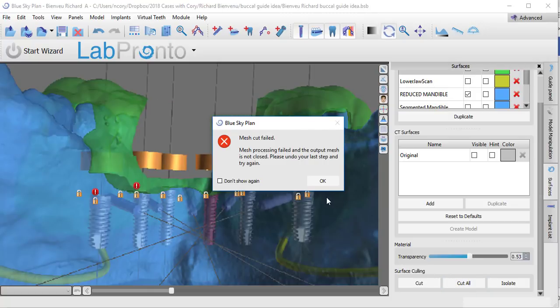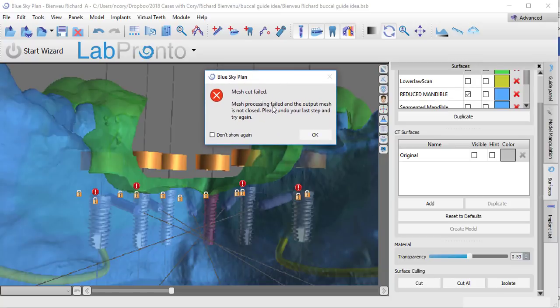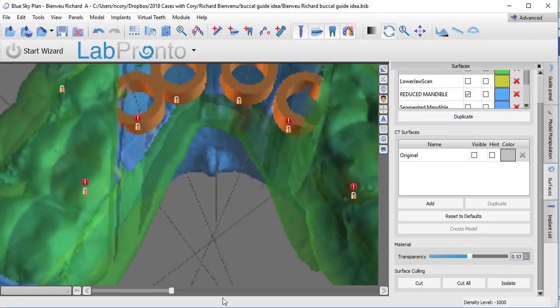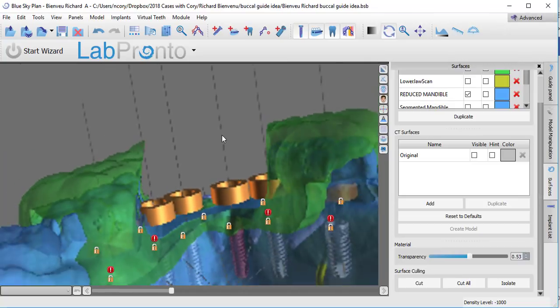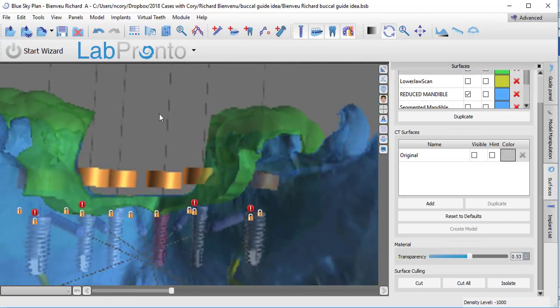All right, there's cut number one. Now, you will get this error sometimes. It's going to say that the mesh processing failed. And what that's telling you is that when it was making this cut, there's some areas that it was unable to close the mesh. And in fact, I can see that right here. You see that the mesh is kind of transparent. You can go right through there. That's okay. We're going to repair that at a later step, so don't really worry about that right now.